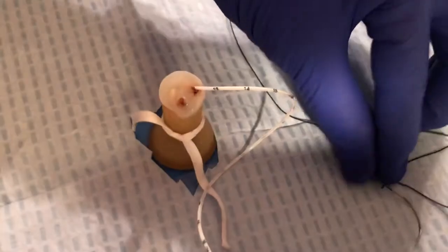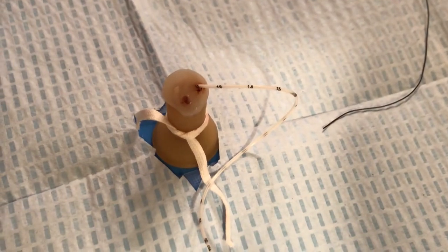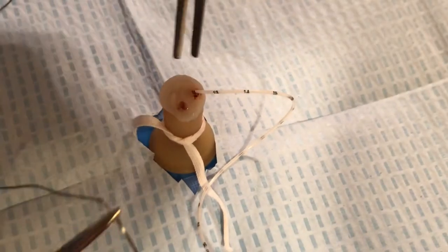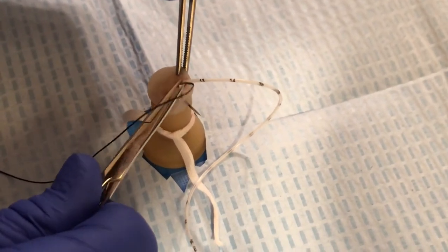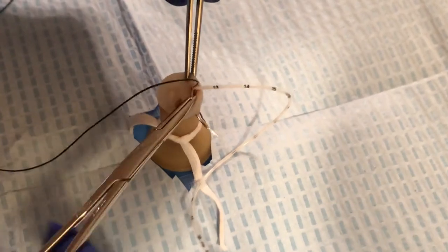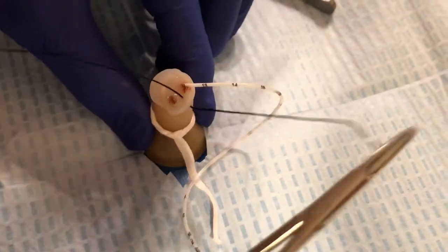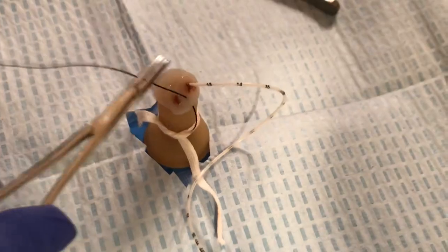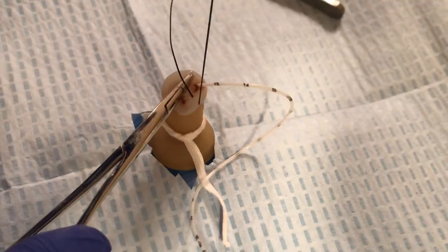We will begin by taking one bite out of the umbilical cord. We want it to be a good-sized bite and away from the arteries. Taking that good-sized bite out of the umbilical cord, we are going to secure it with two flat simple instrument knots, leaving a bit of a tail.